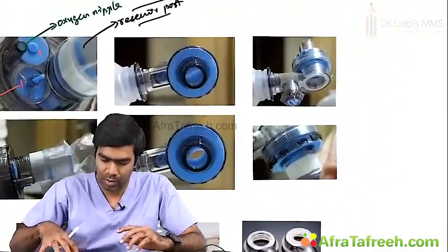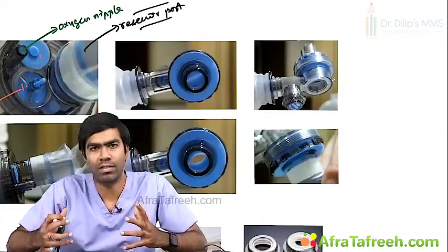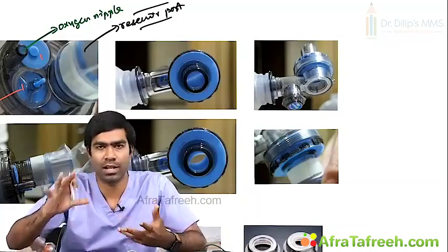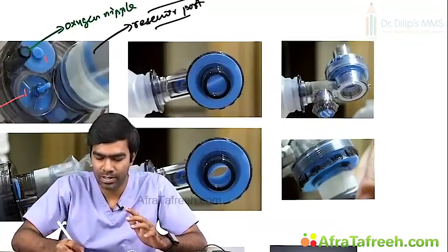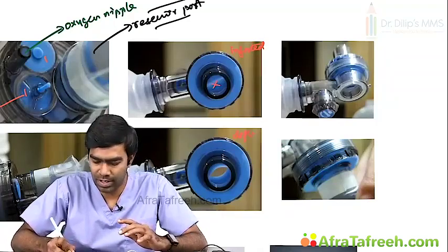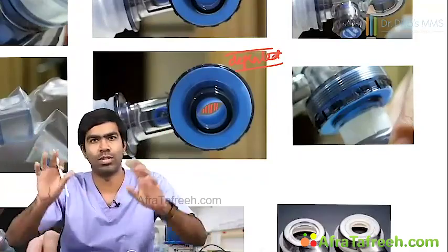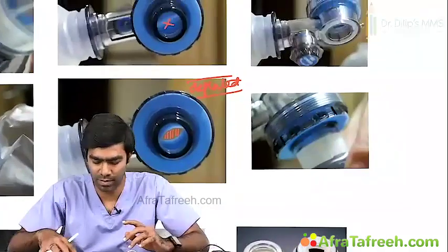And you can see the outlet area. Outlet area will be called a fish mouth valve. That outlet valve, especially when you are using a Laerdal valve. So Ambu may or may not have a fish mouth valve, but Laerdal devices will have a fish mouth valve only. But generally we call it a fish mouth valve. What do you mean by fish mouth valve? When the bag is inflated, you can see the valve will be closed. When the bag is deflated, that is, when you are compressing the bag, you can see the opening is like a fish mouth and pushes the gas outside. So this is an outlet fish mouth valve. That's an expiratory valve or a patient valve.